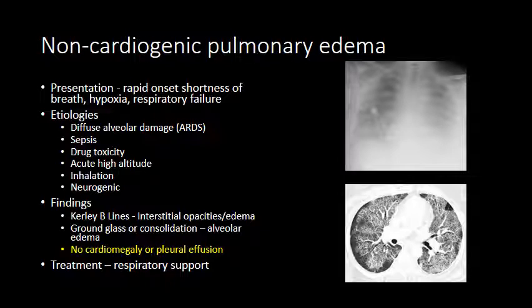Similar to cardiogenic edema, you can get Kerley B lines from interstitial edema and ground glass or consolidation from alveolar edema. Distinguishing it from cardiogenic edema, there is no cardiomegaly and no pleural effusion, and you typically treat it with respiratory support.